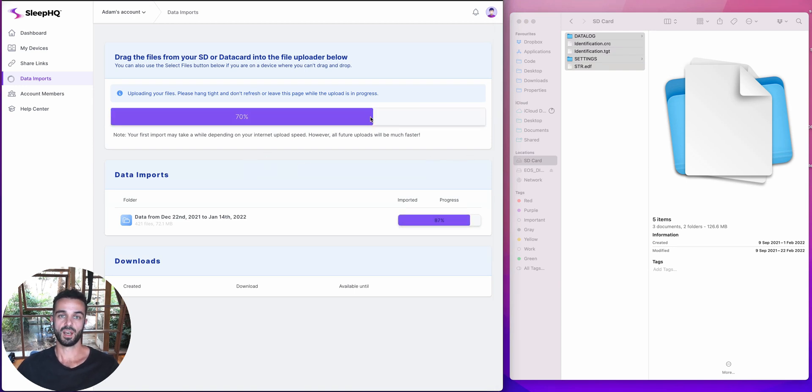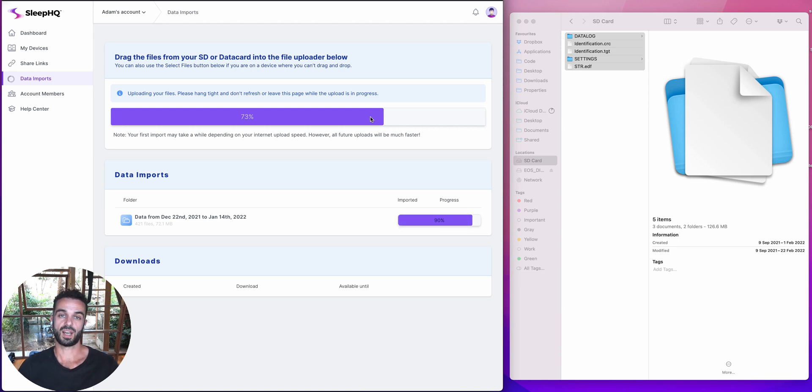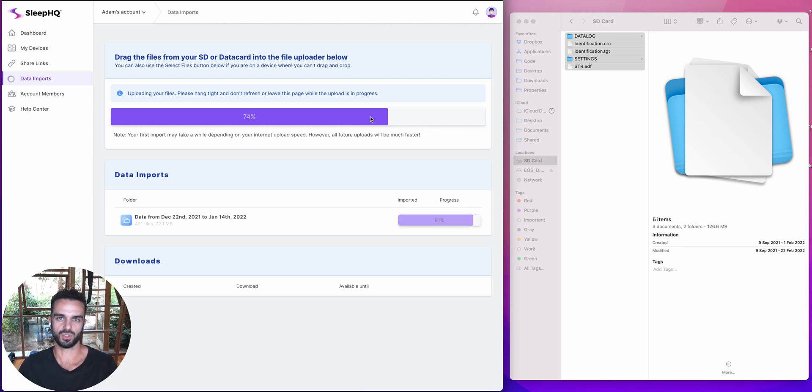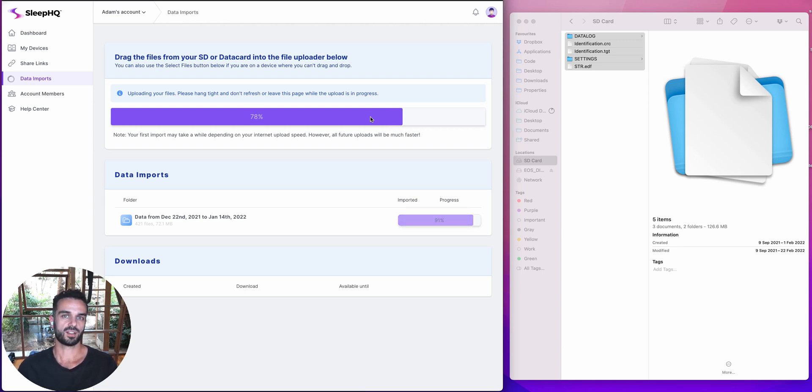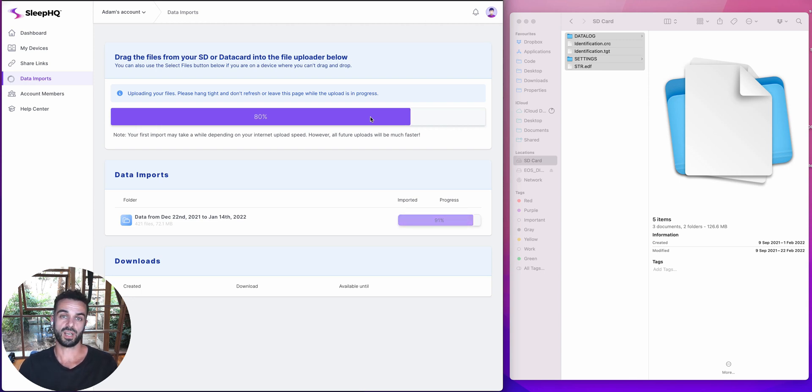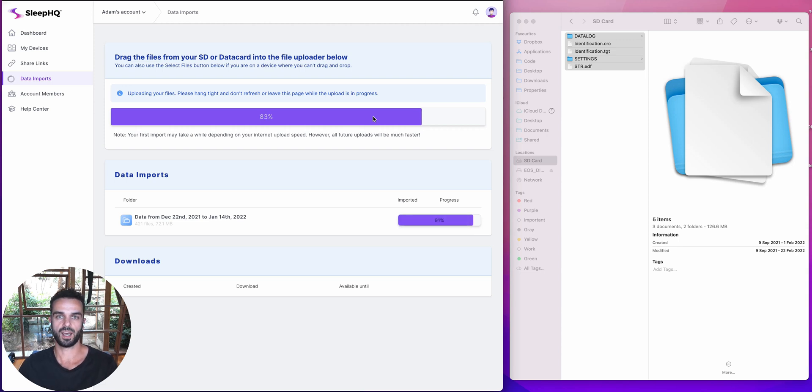It jumps straight to 69, 70% because all of those other files had already been uploaded the last time around. So it doesn't need to re-upload them or to reprocess them. So what's going to happen when you do this, if you're only uploading a day or two's worth of data, because it's only been two days since you last did an upload on Sleep HQ, it's going to be really fast and also really easy. You don't need to remember which files you uploaded last time. Drag the whole thing in. Sleep HQ will keep track of which files we've seen before and only upload the new ones. So you can see straight there. It was really quick for me to upload my most recent data when I did that. And that was with two weeks worth of data in there.